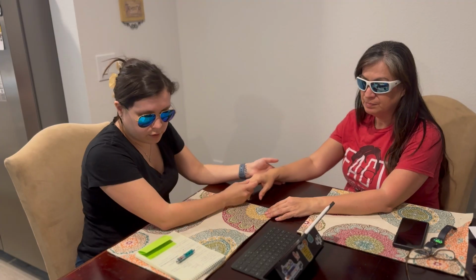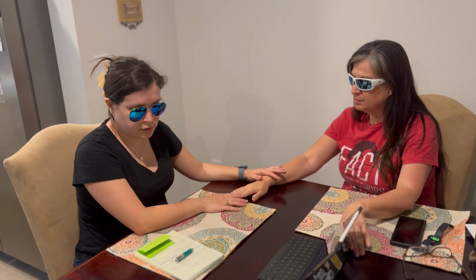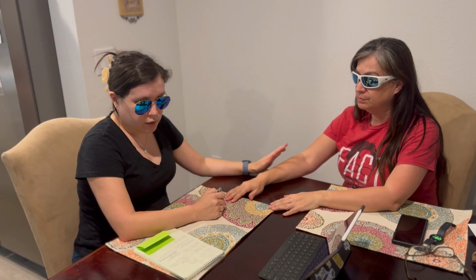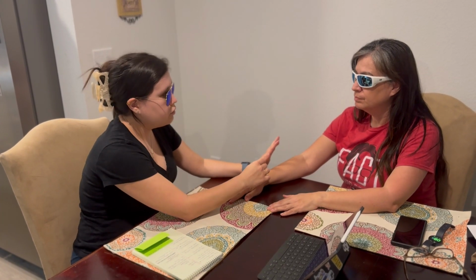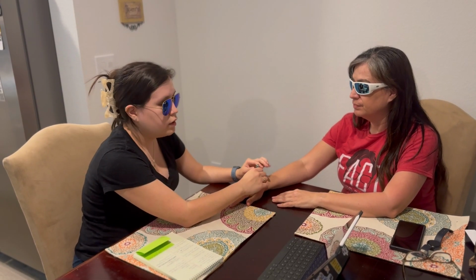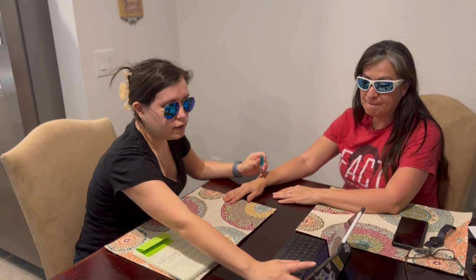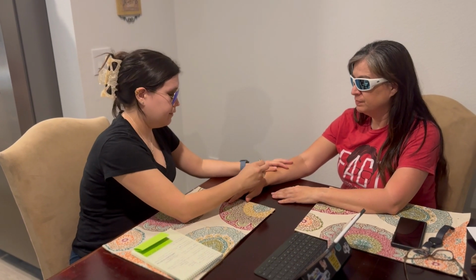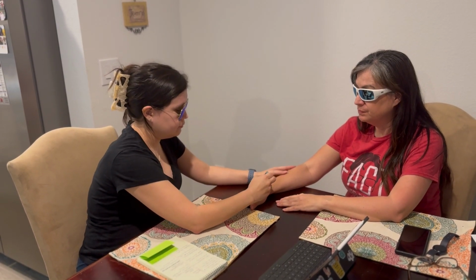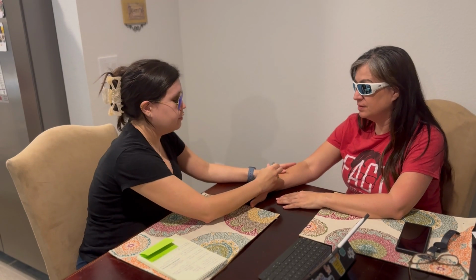So I'll start with your left hand here. We're just going to keep it laid out on the table like this. This is my laser. I'm going to have the wand and do a slow sweeping motion along your wrist while applying the laser. Like I said, if it gets too hot or uncomfortable or anything feels wrong, just let me know and we'll stop. Okay. Thank you. Is that okay so far? Yes, that's good.